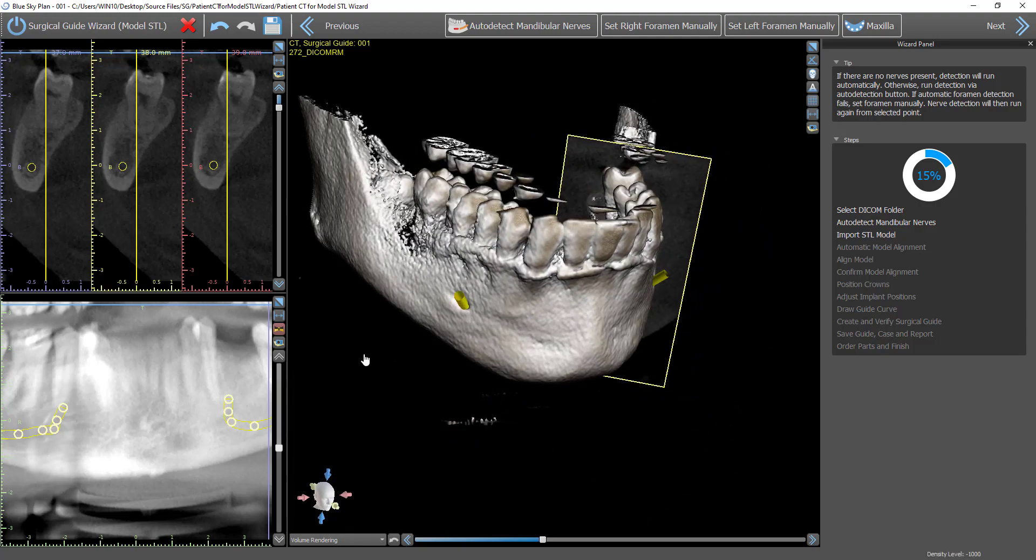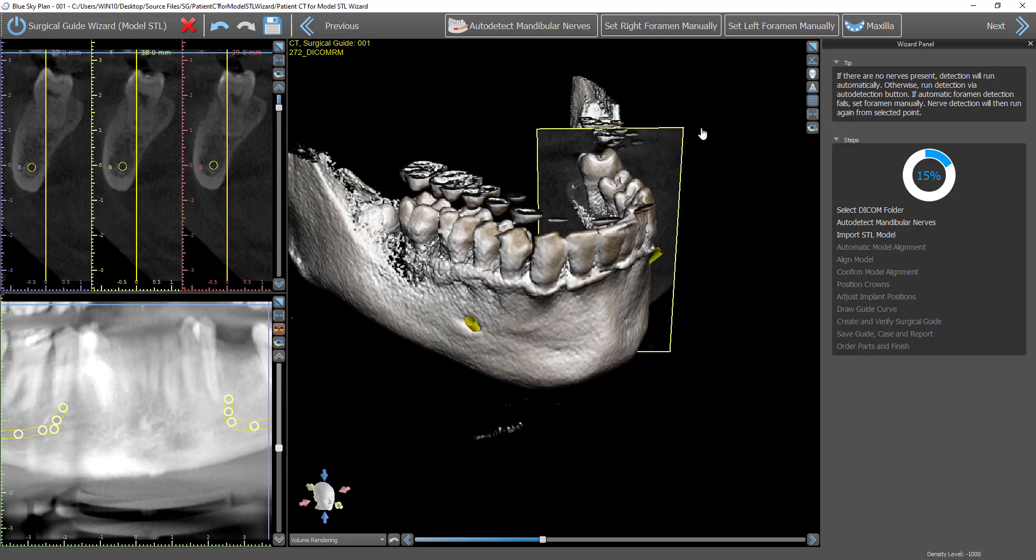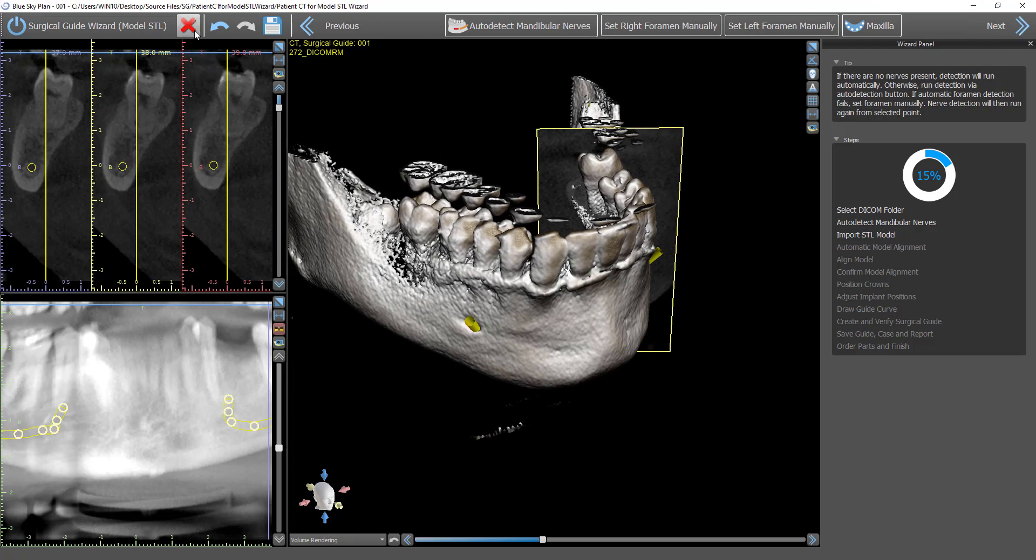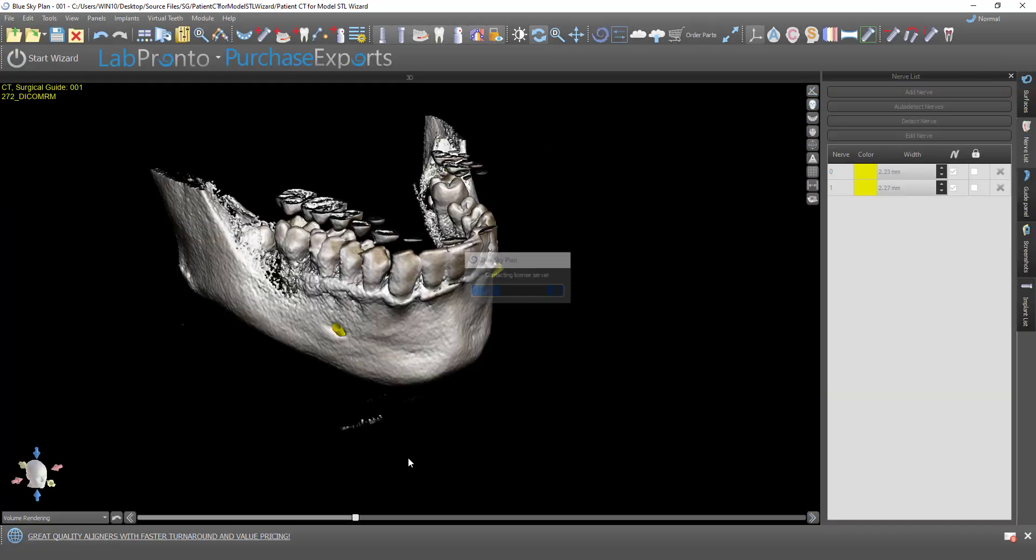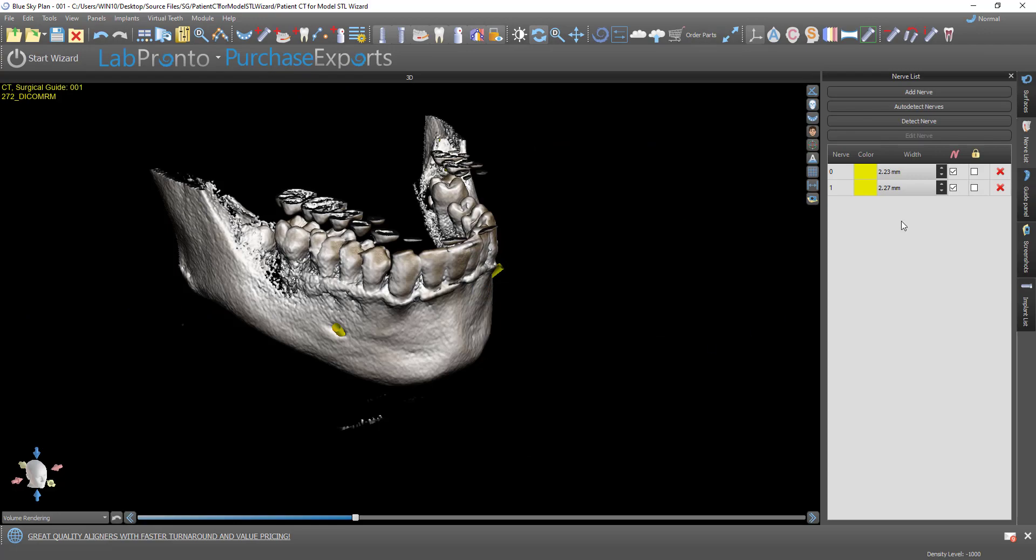Continuing with the wizard would be as simple as clicking on Next and continuing with the process. What I'm going to do now is go ahead and cancel this. I'm going to take a look at it in Normal and Advanced.